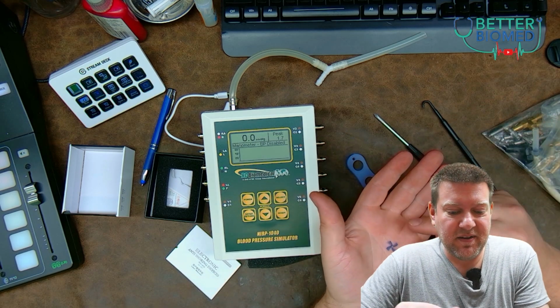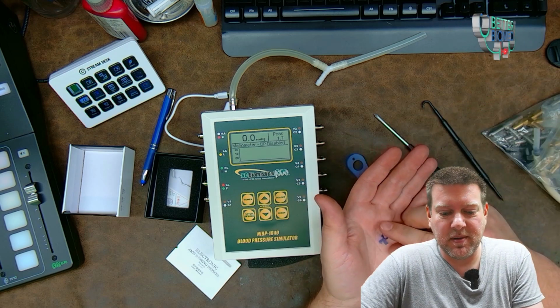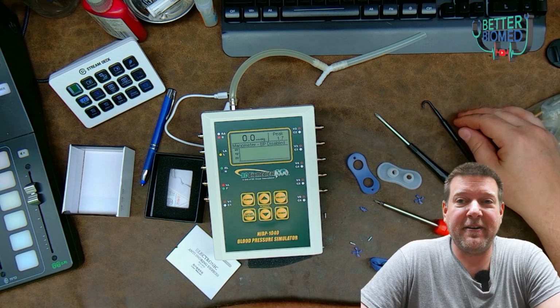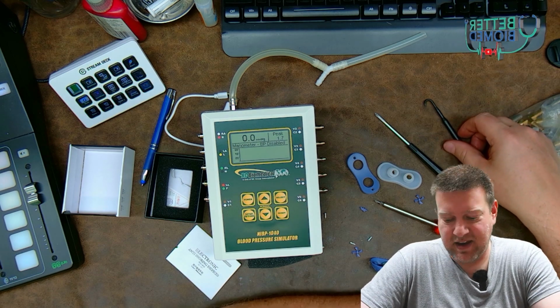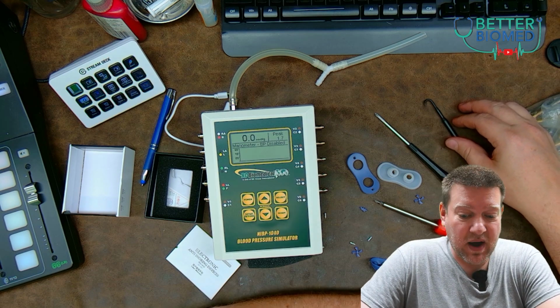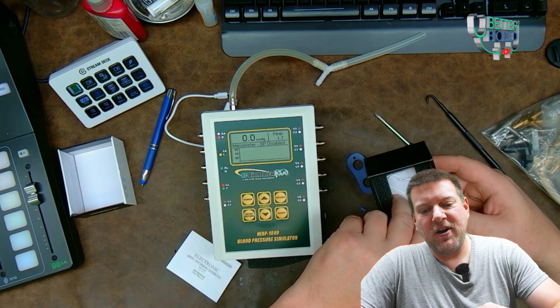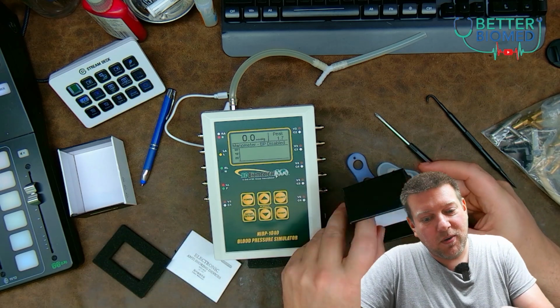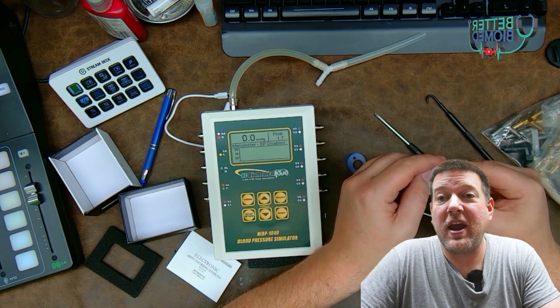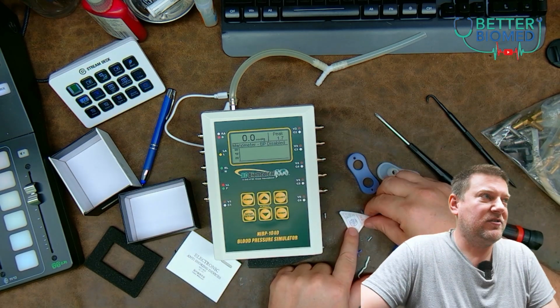Now these fans right here, they were only designed to spin and give you the impression that they're doing something, because a large percentage of the world's population is gullible enough that they will believe absolutely anything. And especially if you make it cheap, people will buy it. So I bought it for what, $299, just to bring it here, take it apart for y'all. And I want you to know that it is perfectly fine to shove this thing up your nose and to go to sleep with it attached to your face, because it passed the quality control.